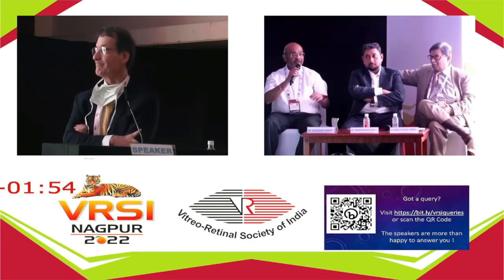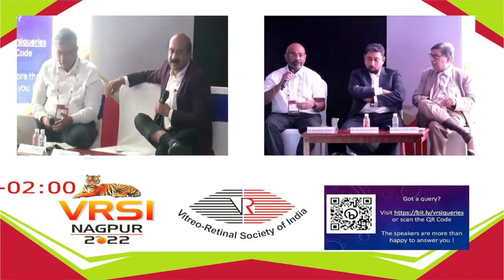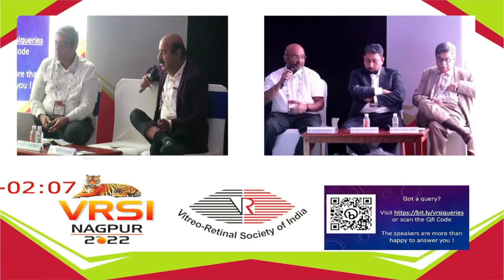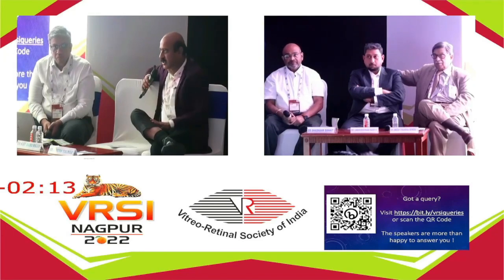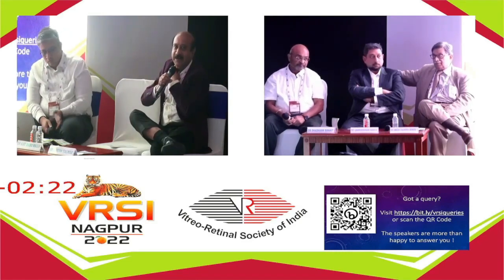Sir, I think at baseline we should have an FA and OCTA both, and on subsequent follow-ups OCTA is a better way to follow up the patient, because we would then be avoiding giving the injection. I think that's a better way to follow. Sir, one more. As the vice panel is suggesting, it is not going to replace the dye-based tools. It is actually adding more things, like the follow-up. You need not give the dye.